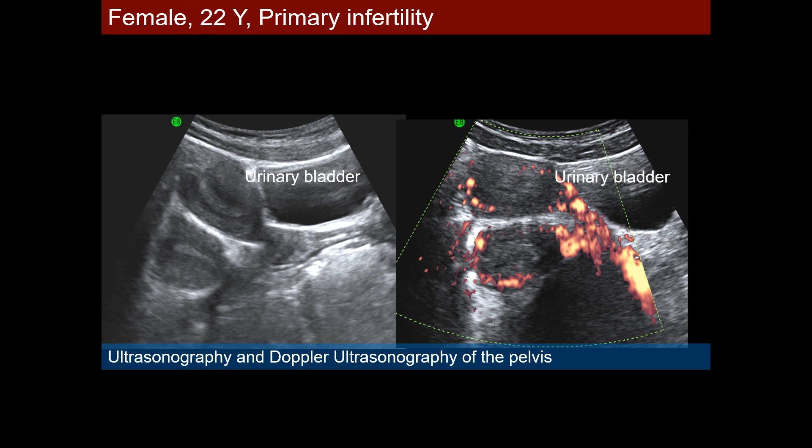Our next case is a female, 22 years old, with primary infertility, and here we have the ultrasonography and the power Doppler ultrasonography of the pelvis.